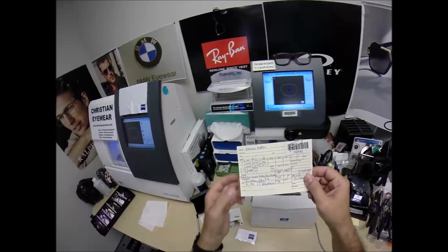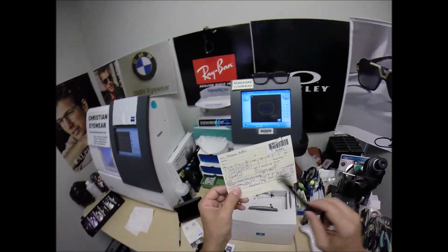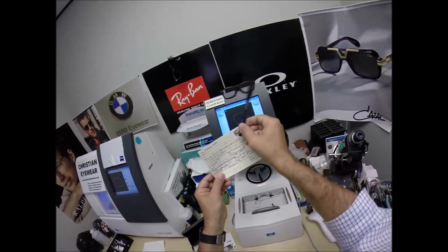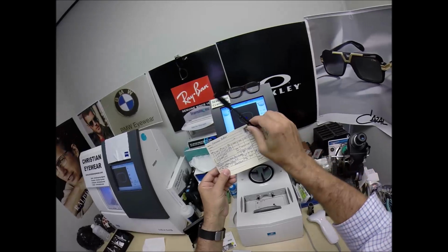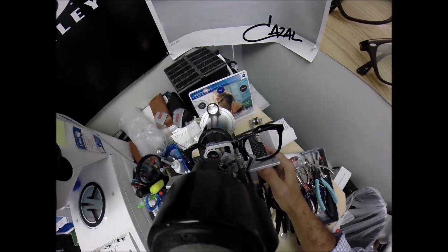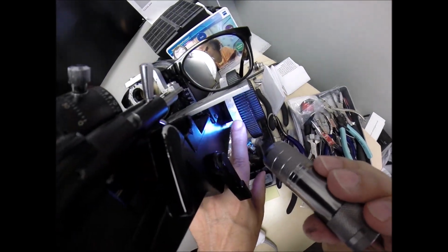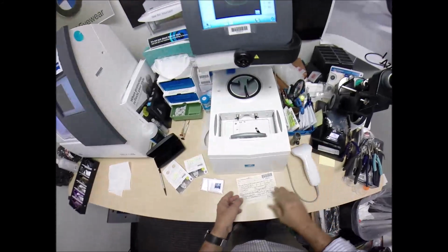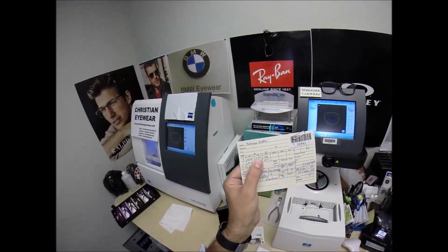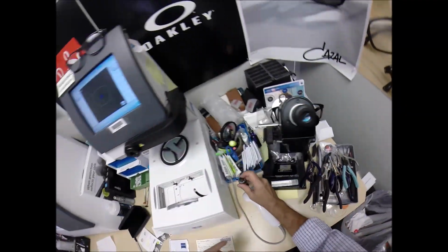Now uncorrected astigmatism makes 6s and 8s look alike, or the letters P and F. Think of it as the fine-tune knob, and we're going to turn that fine-tune knob again. Straight line 0 to 90 to 180. We're going to turn that fine-tune knob to about 136. So let's check the second curvature on the lens. We're now at 0.75, 1 tick mark away from 1 going back towards 0. That's because if you had $1 and you gave someone 25 cents, you would have 75 cents left. That's where we are, at 0.75 in the black.